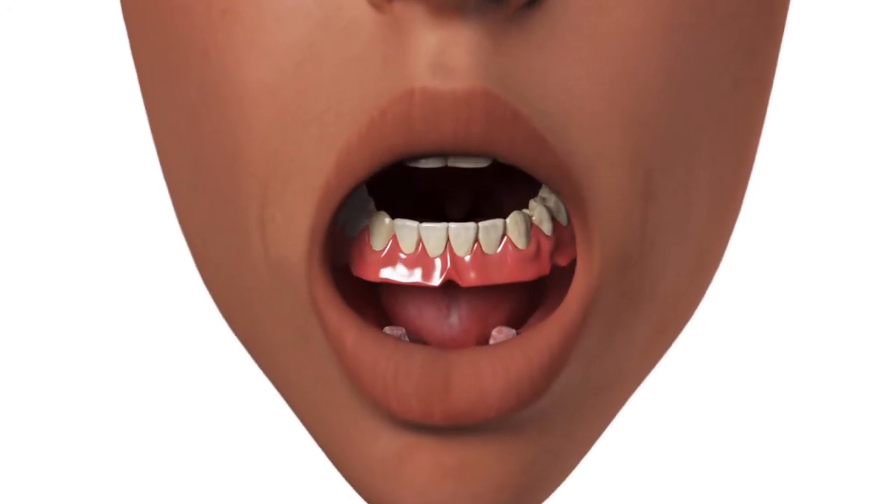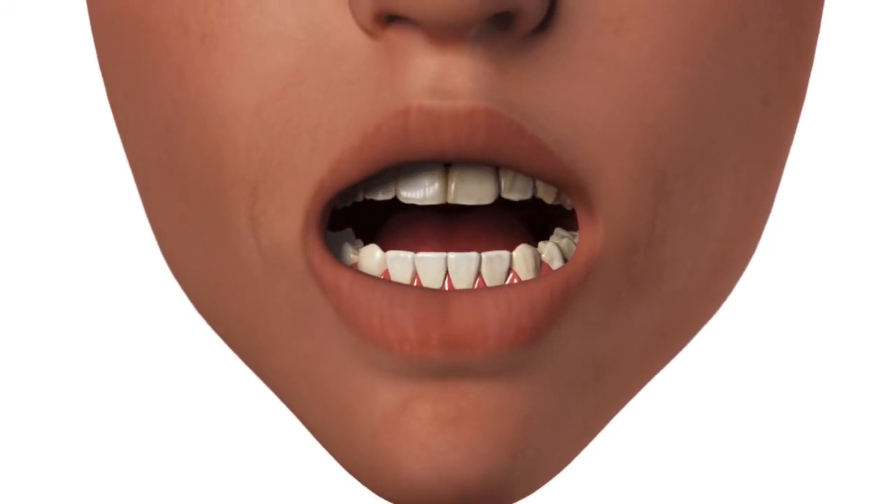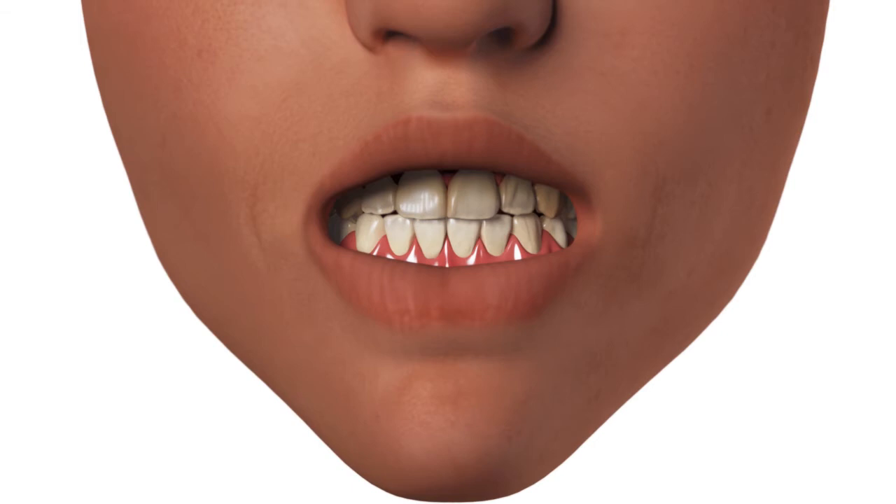Insert the denture and guide the patient into occlusion. Maintain the denture in a passive position without compressing the tissue while the acrylic sets.